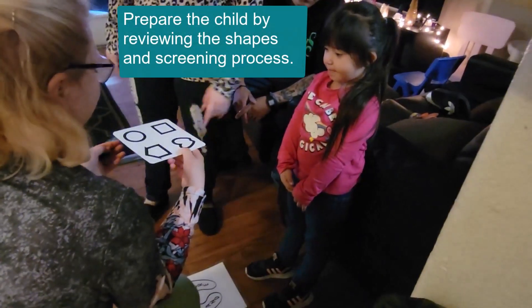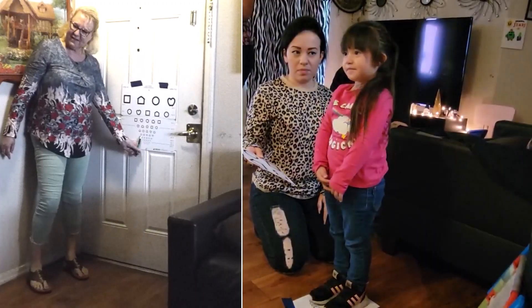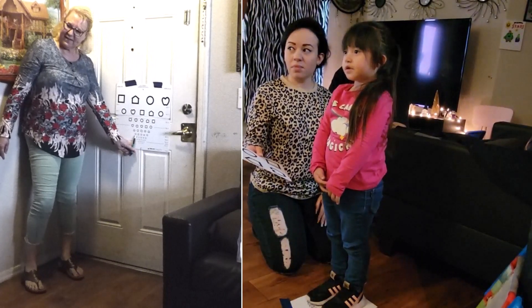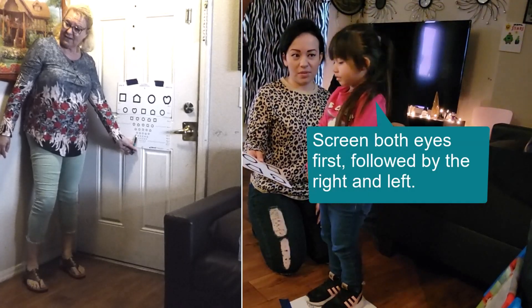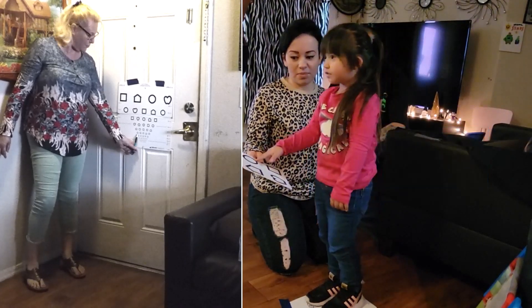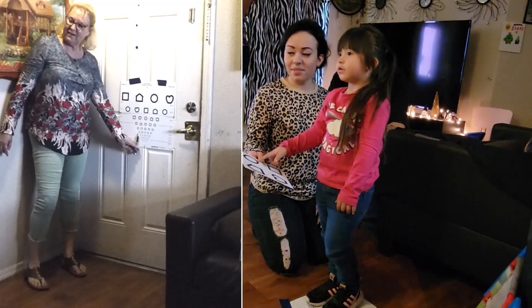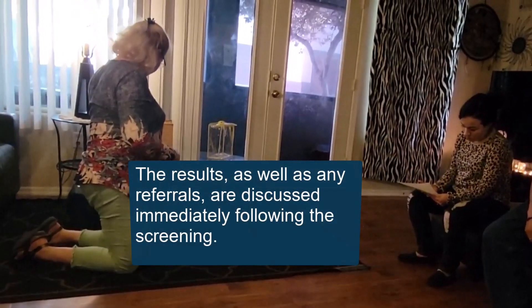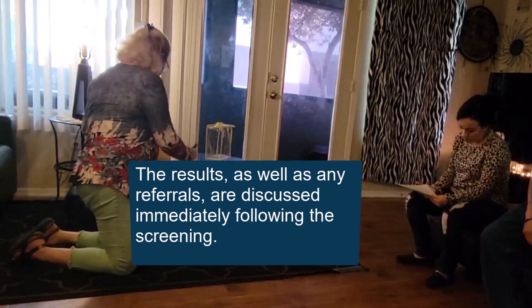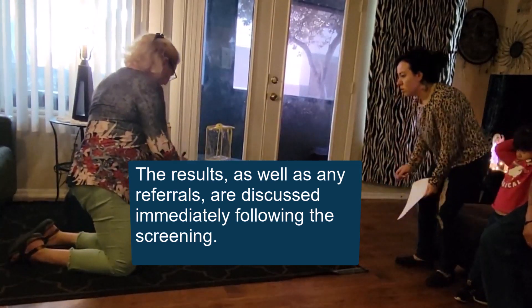Prepare the child for the screening by reviewing the shapes and process. You may need to enlist the help of the parent or caregiver in helping the child follow directions and hold the occluder. Screen both eyes, then the right, then the left. Once the screening is complete, review the results with the caregivers — this may be a pass or a referral to an eye care specialist.